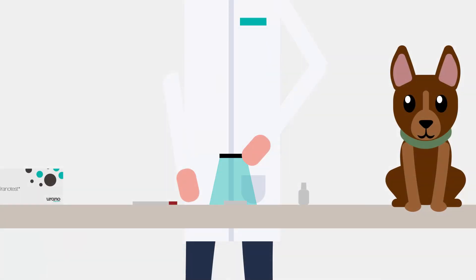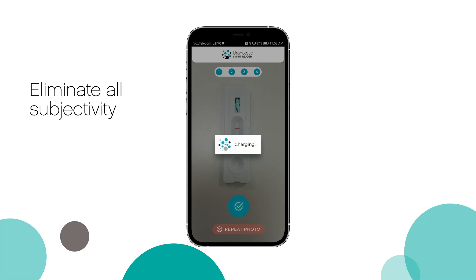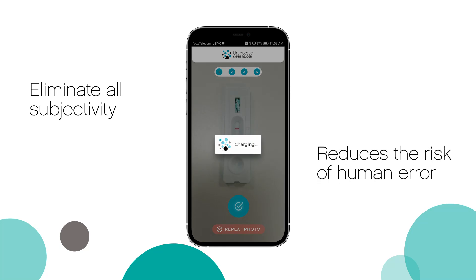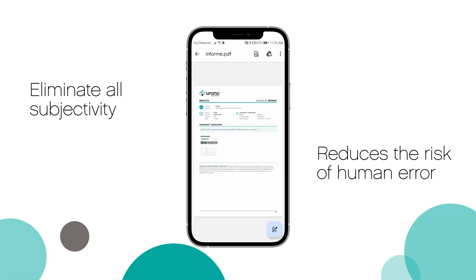Urano Test Smart Reader eliminates all subjectivity of visual reading and reduces the risk of human error, providing immediate results.